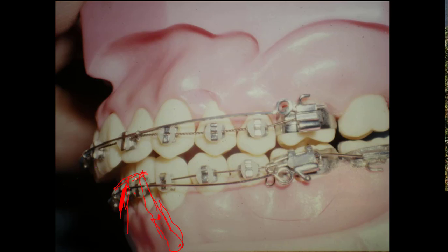So you don't want to dump them out any further than you have them. You come in and put this tie back in here so the space doesn't increase and you don't have to torque it very much. But sometimes you really need to get in here and torque these teeth and bring these roots forward. So I'm going to show you how we do that.